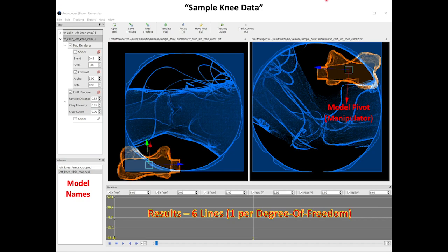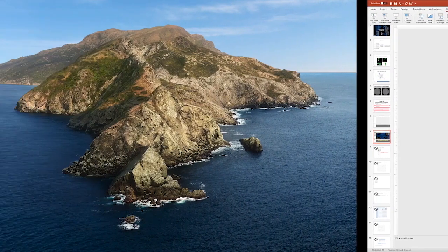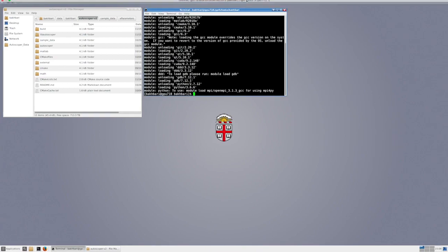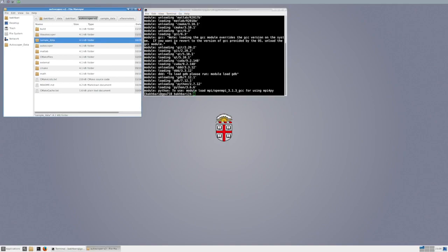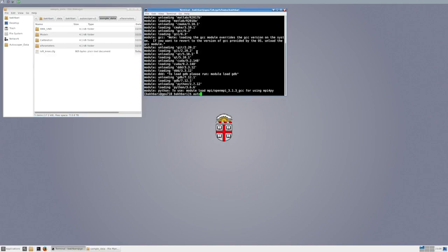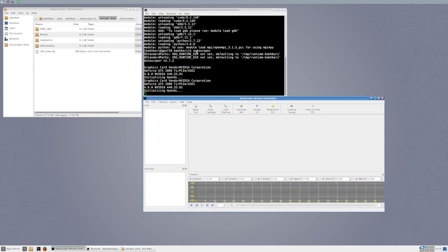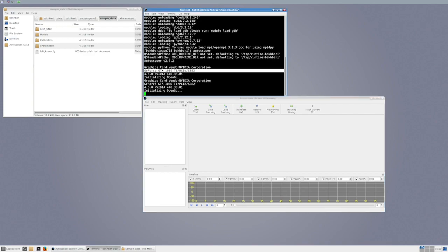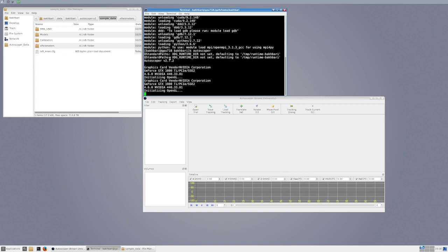Here you see me using the Brown HPC high-performance computing system, and I'm going to load some data. After loading Autoscoper you can see your graphics card and driver information. For Autoscoper to run properly you need an NVIDIA graphics card because the code is CUDA-based, and you need updated graphics card drivers. The version I'm showing here is version 2.7.2.